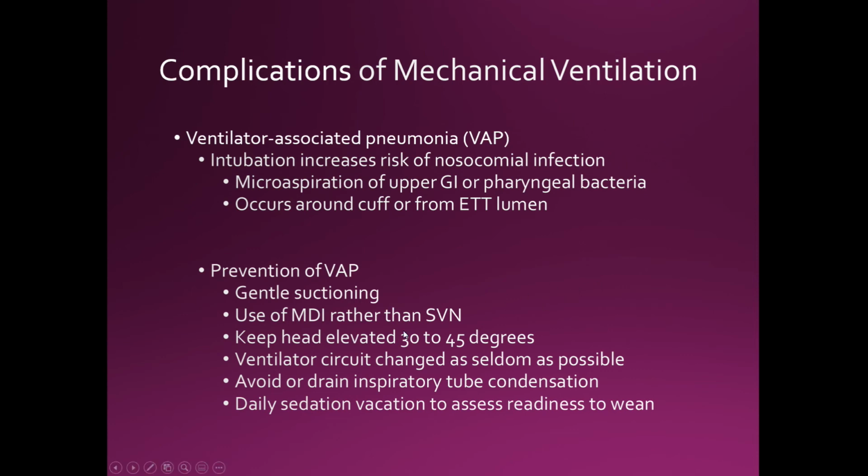Use of a metered-dose inhaler rather than an SVN. Again, we want to avoid pressures pushing into the lungs. MDIs are more dry powdered, so it's going to be based on inhalation rather than any type of pushing of air or oxygen. Keep head elevated, yes, and then keep the ventilatory circuit changed as seldom as possible.